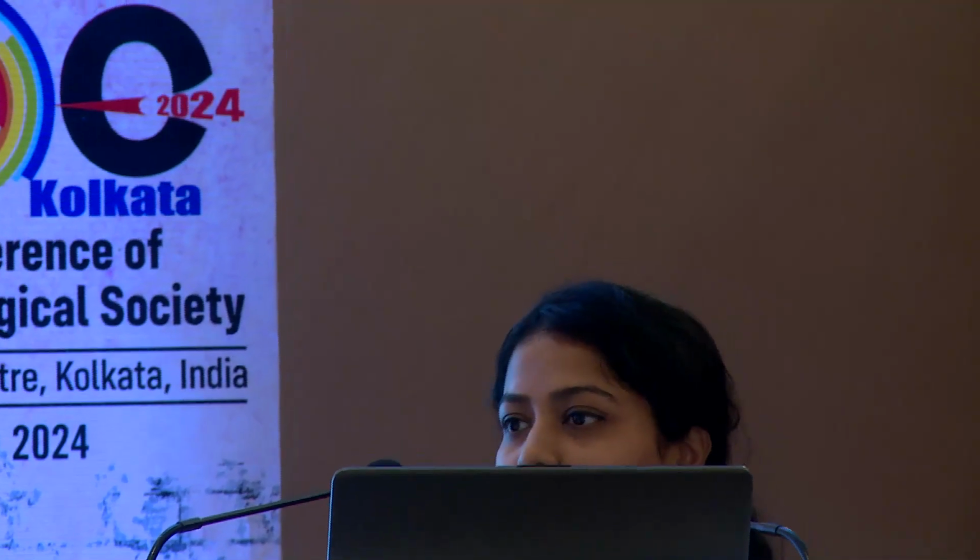Okay. And it also depends on the degree of dilatation, isn't it? Yes, ma'am. How many millimeters you are dilating, whether it's fully dilated or partially dilated. We included only fully dilated patients here, and any patient with less dilatation we excluded. Right. And as she rightly mentioned, in night vision the pupil is not fully dilated, isn't it? Yes, ma'am. It's only a bit dilated. And in daytime, 12 o'clock, the pupil is very much constricted. Yes, ma'am, there's a diurnal variation of the size of the pupil. And illumination in the clinic also.